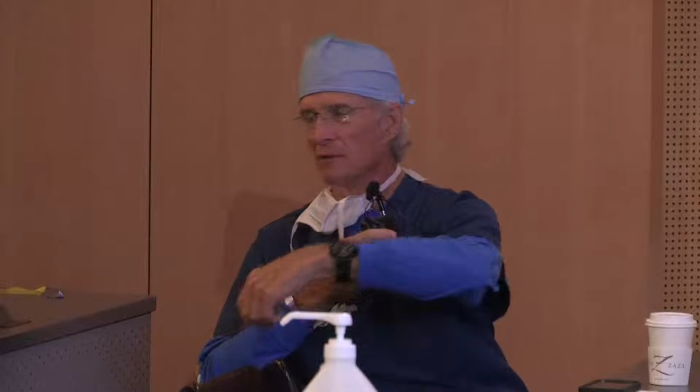You can call for help. You can make sure you've got covered stents in the hospital. You can call one of your partners, you can put other IVs in, you can make sure you got blood in the blood bank, you've got all kinds of options once the balloon is inflated. So it ought to be a reflex. You see extravasation, just put the balloon back up.